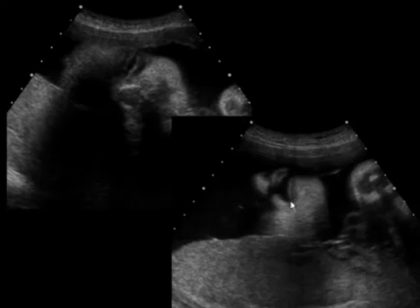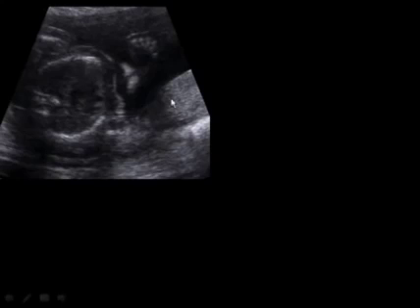You can see the lower lip here and the upper lip, and there's a cleft indeed coming from the right nostril down into the upper portion of the mouth. So make sure that to call a face normal, that soft tissue plane of the upper lip is seen in completion.